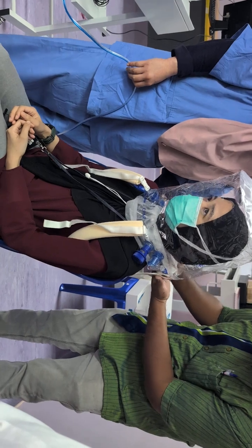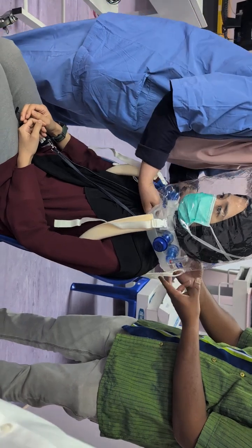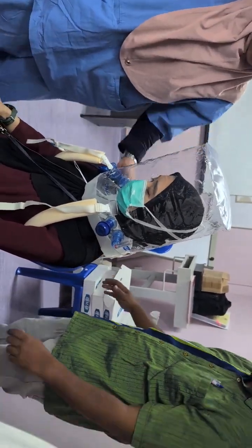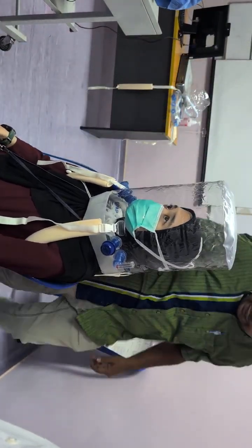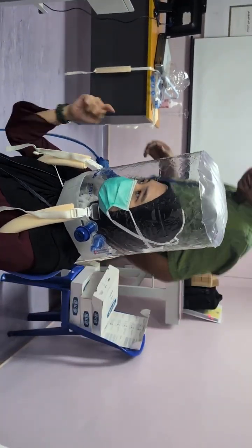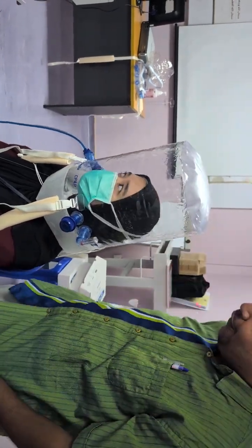Okay, doctor, tighten it more, because I can still put in 2 fingers. Tighten more. Alright. Okay. They're getting it. Is it tight? Yes, tight already, doctor. So you see, the thing here is, you can talk, it's like being on an aeroplane.